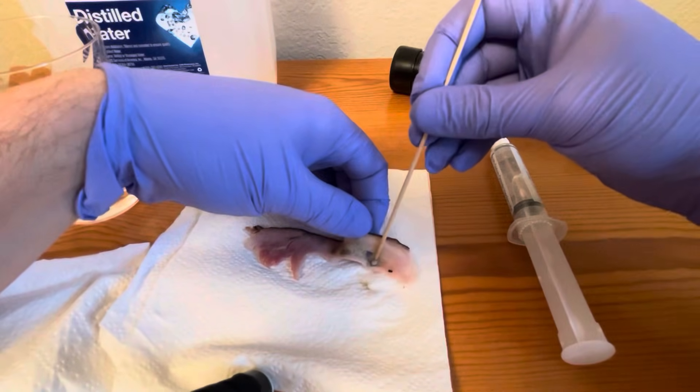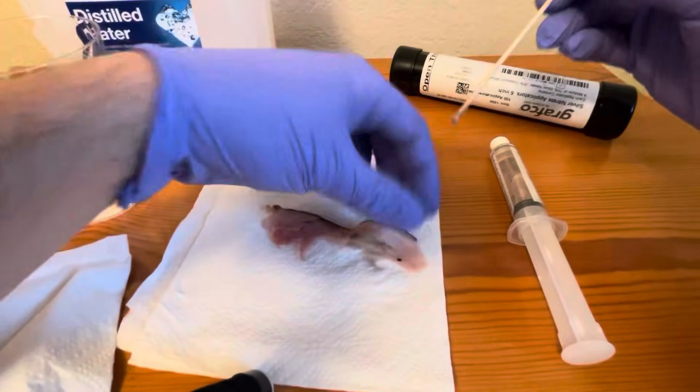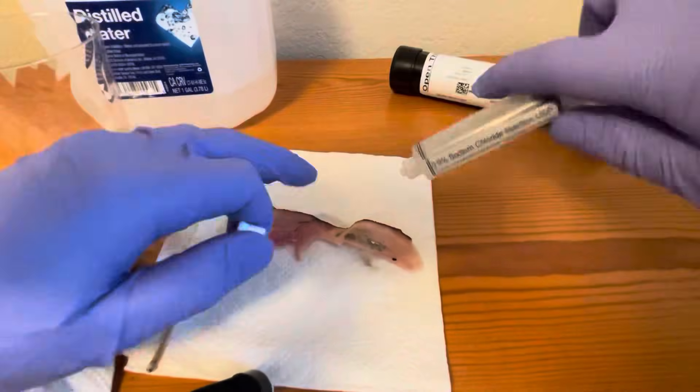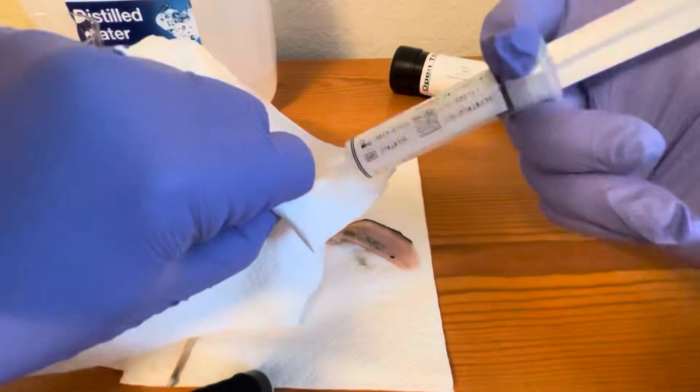After you use the application, it's going to stain the tissue black — it's going to leave deposits of the reduced silver. The stain will usually disappear within a period of two weeks.